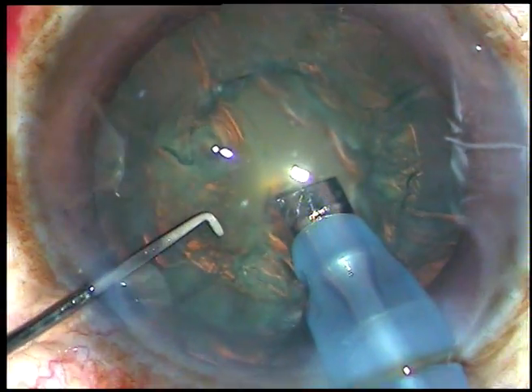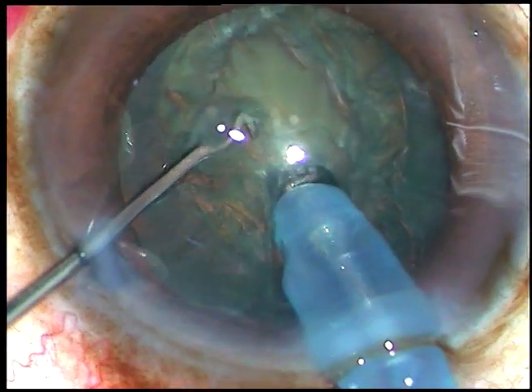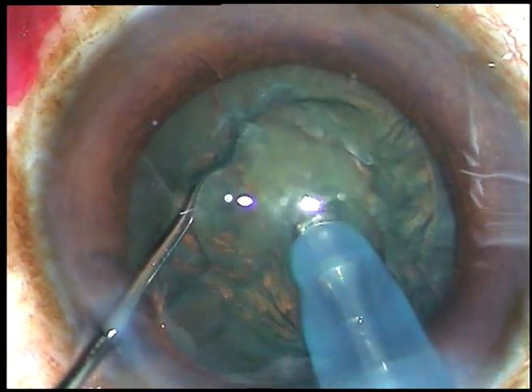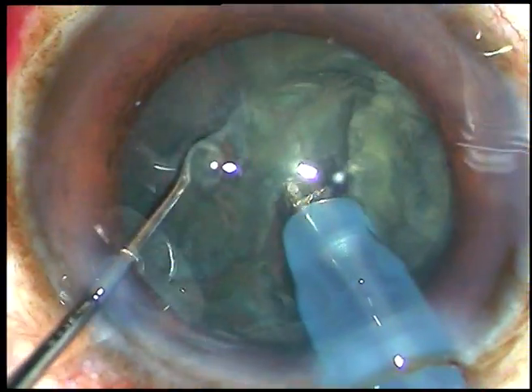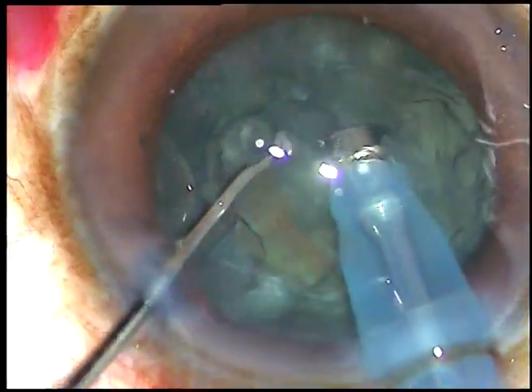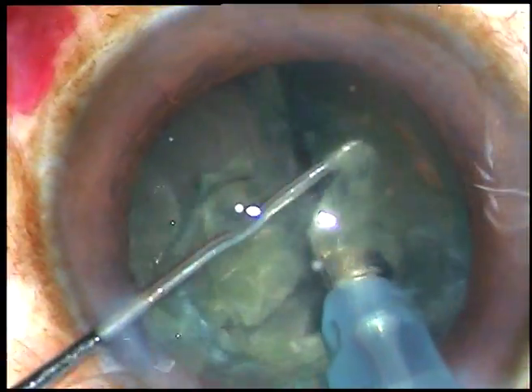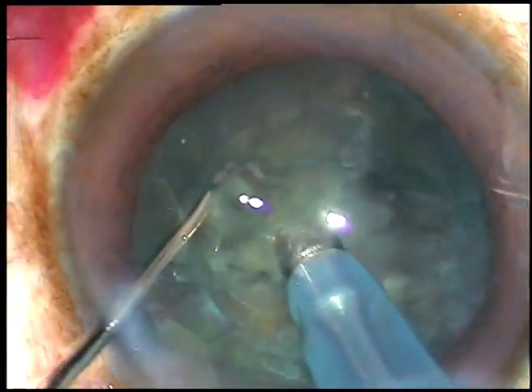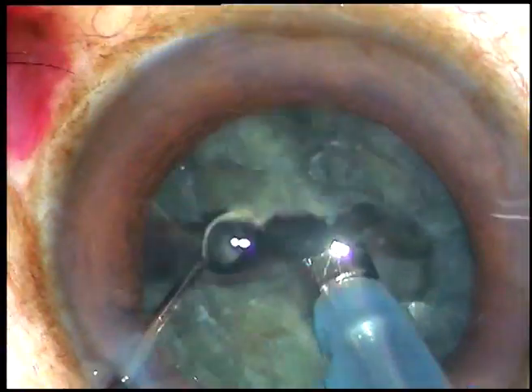And this is direct horizontal chop. Bury the nucleus and chop it like this. Rotate the nucleus, chop it at another place. So the nucleus has been divided first into two hemi-nuclei, and then each hemi-nucleus has been divided into two pieces. Now each piece is further being subdivided as required.